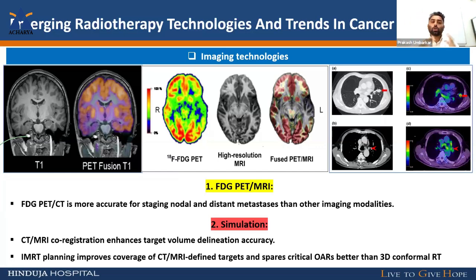We superimpose. Superimpose means, suppose we do not get any clear lesion in the CT scan images, but in MRI we can identify it in T1 contrast, T2 contrast, T1 FLAIR imaging or diffusion images. We get a clearer boundary of the tumor. So if you mark the tumor volume and contour the target volume properly, we get the correct treatment delivery. But without seeing the lesion, we cannot treat the patient.